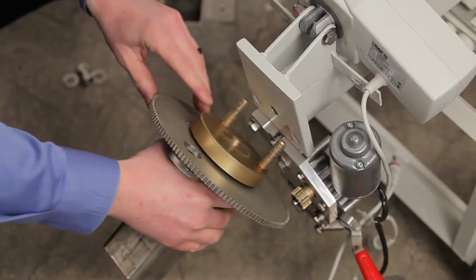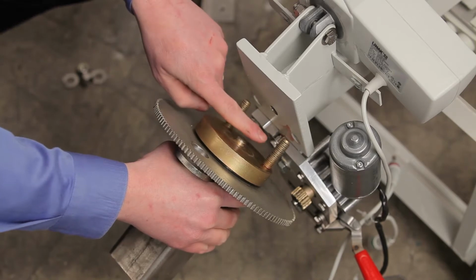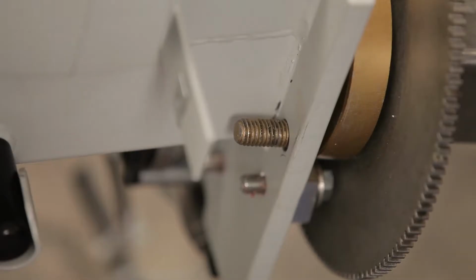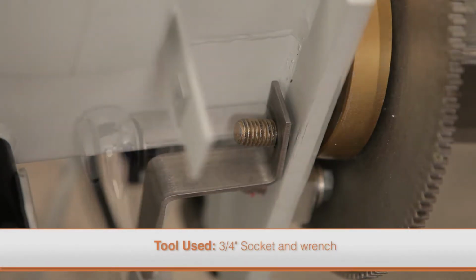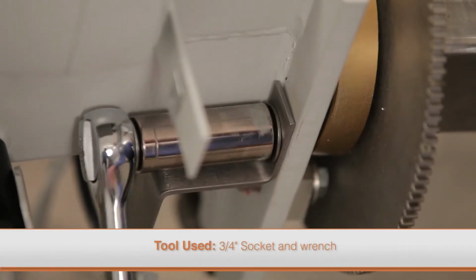To replace the new hub assembly, align it so that the mounting studs are oriented closest to the motor assembly. Reinstall the support bracket and install and securely tighten both nuts.